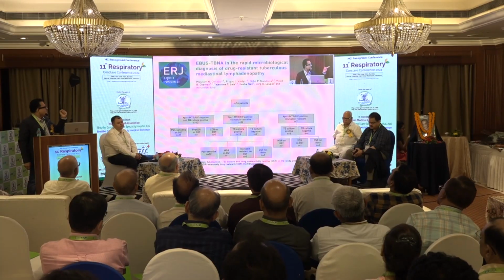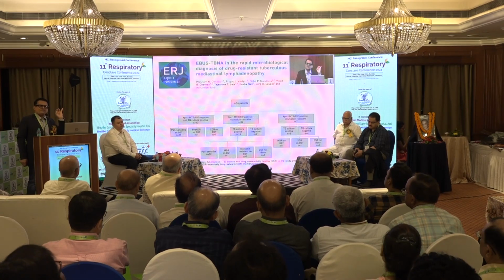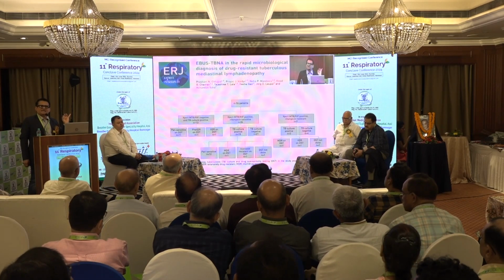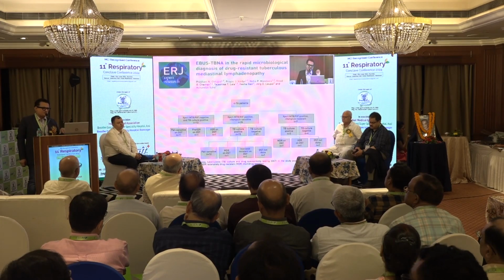This is the first paper which was published, we published this from India in 2019, the world's first paper showing the utility of the EBUS TBNA technique in the diagnosis of drug-resistant tuberculosis. So this is the value of this technique, and we know that TB is one of the most common infections in our country and this can be utilized well.